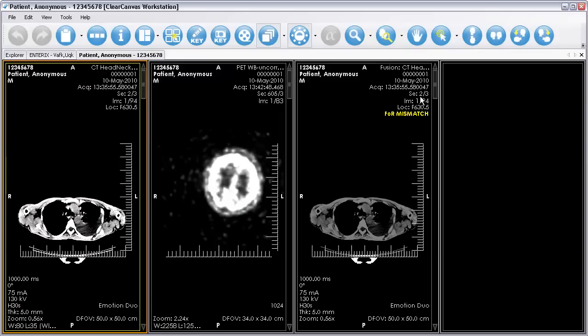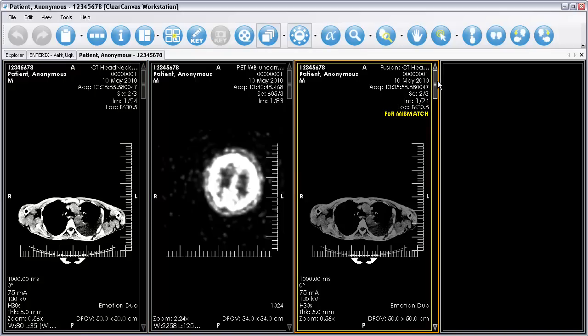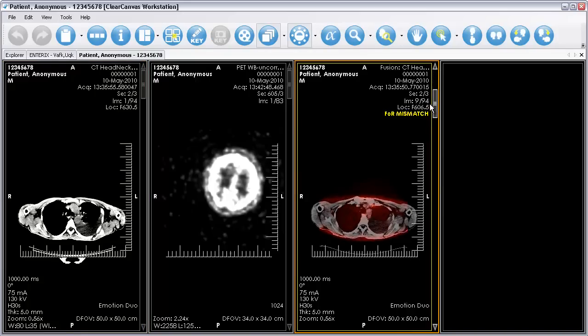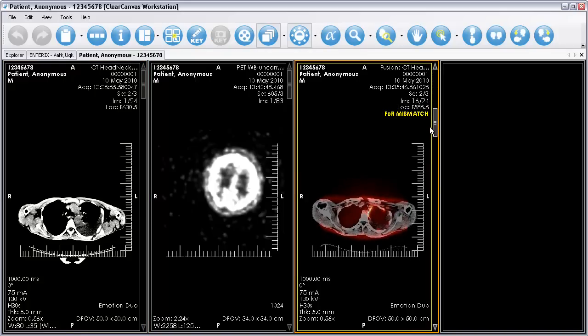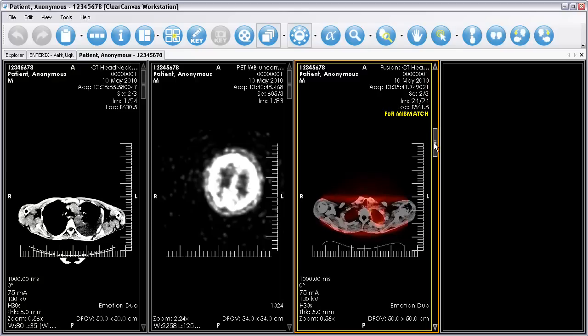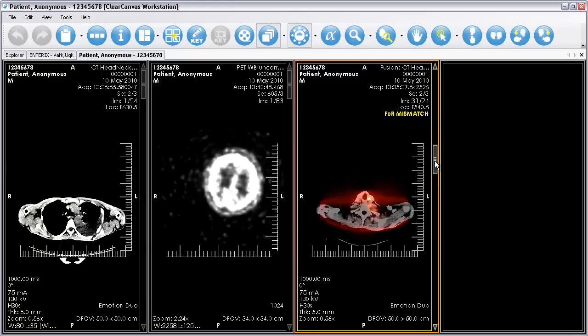Here, you can see a Fusion display set generated on the right, with the PET images being recolored and overlaid on top of the corresponding CT images.